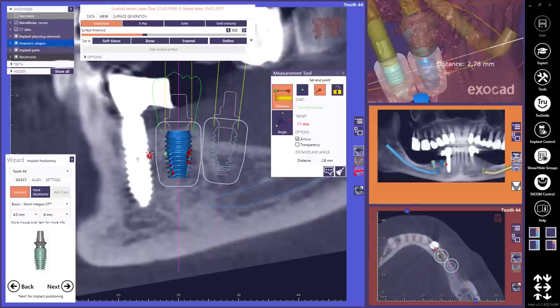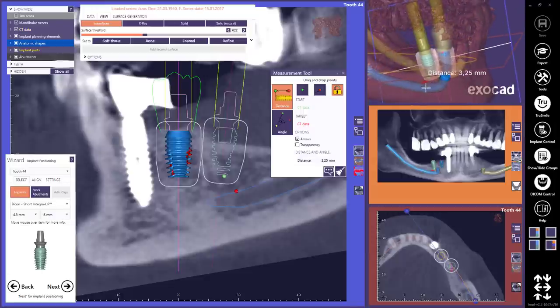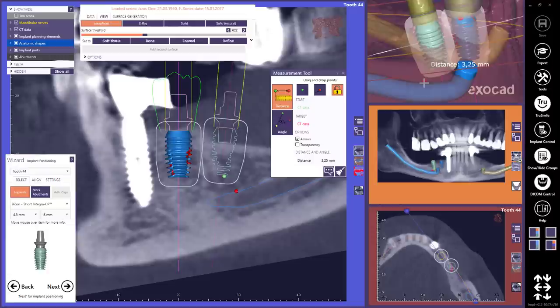Already placed measurement points can be moved by dragging them. During movement, the measurement value is always updated. An existing measurement can be used as an annotation, which is permanently associated to scene objects. To convert a measurement into an annotation, click the annotation icon in the measurement tool.